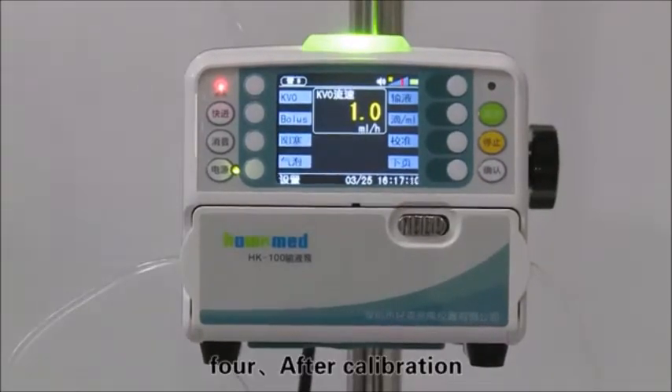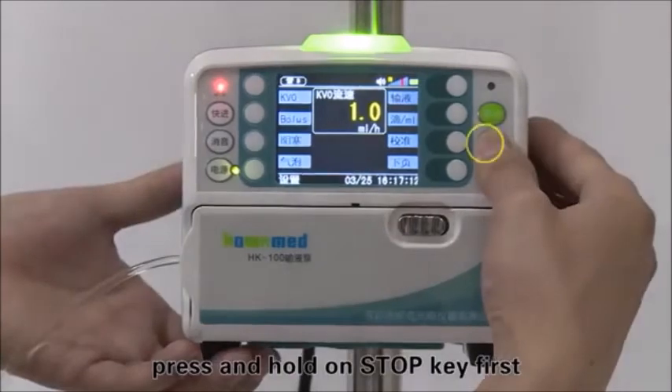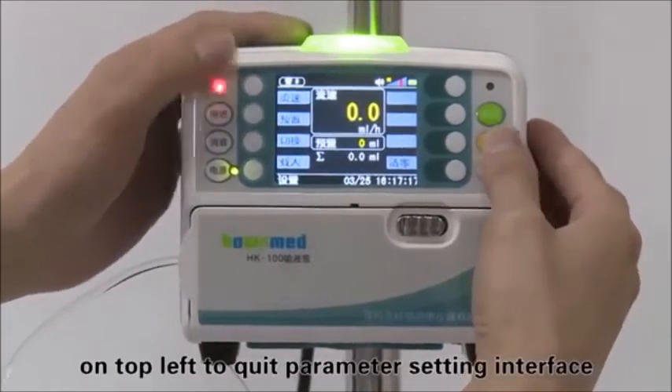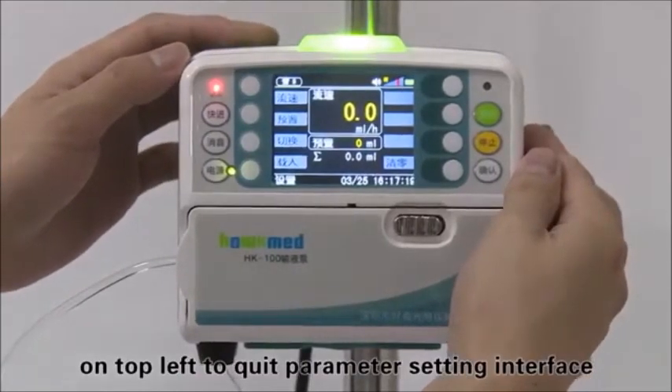After calibration, press and hold the stop key first, then press the first soft key on the top left to quit the parameter setting interface.